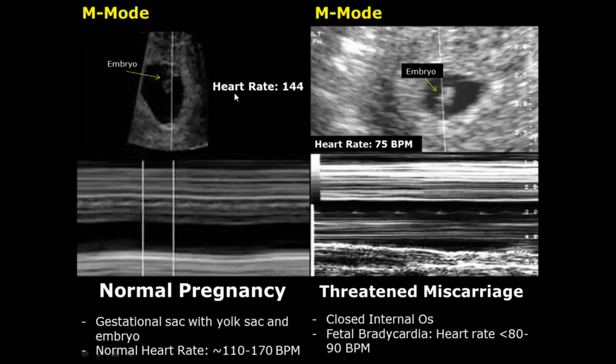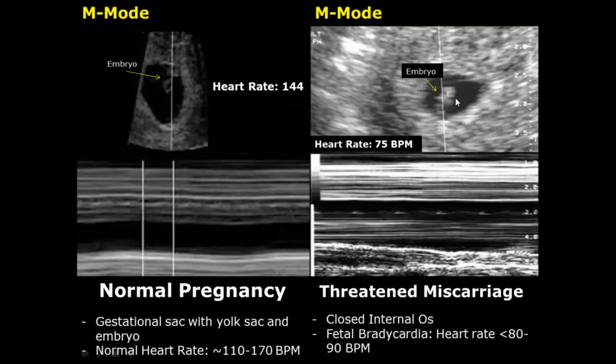Here the heart rate is 144 beats per minute, which is within normal range. A miscarriage is the natural termination of pregnancy before 20 weeks. The first type is the threatened miscarriage. One feature is fetal bradycardia — the heart rate will be below 80 or 90 beats per minute; in this image it is 75 beats per minute. This feature is just a suspicion and not a confirmation that the pregnancy has failed.